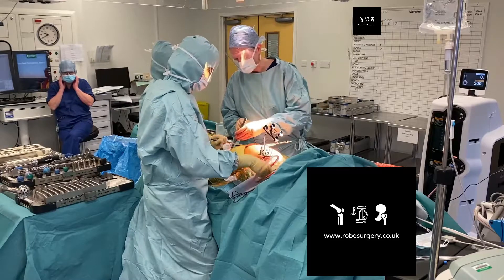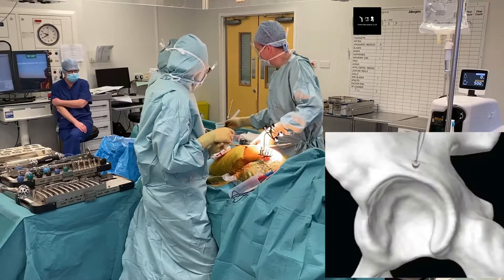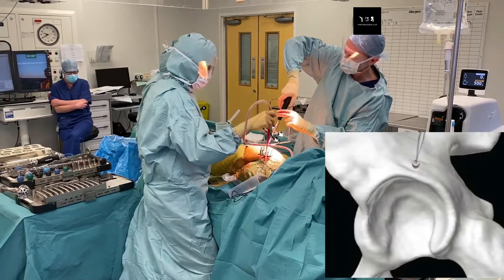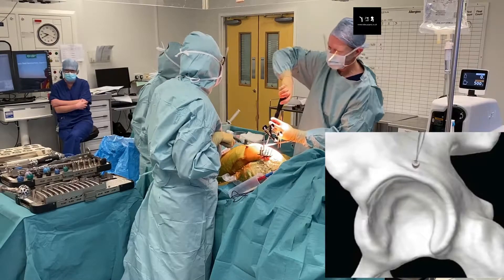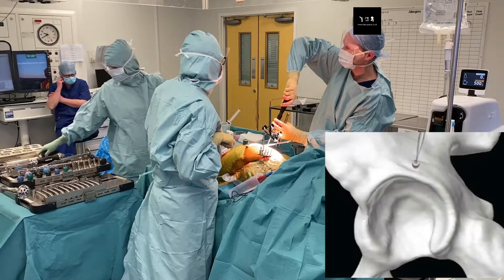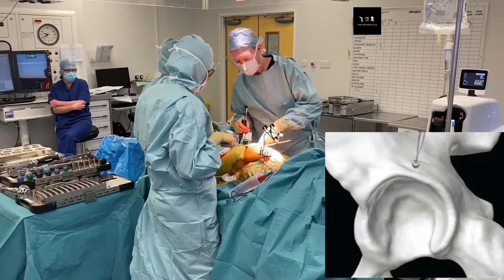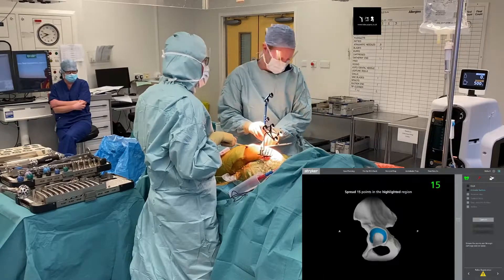Here I'm excising the labrum as you would in a standard approach, identifying the superior part of the acetabulum, dividing some of the soft tissues about a centimeter to the rim of the acetabulum, to enable me to place an acetabular reference pin which is threaded into this position. This pin is very important and it's important that it doesn't change position throughout the procedure, so it's quite a rigid fix. We have to make sure that it's away from where we're performing the reaming, and it acts as an indicator to check and verify the position of the pelvis, the trackers, and the robotic system itself.